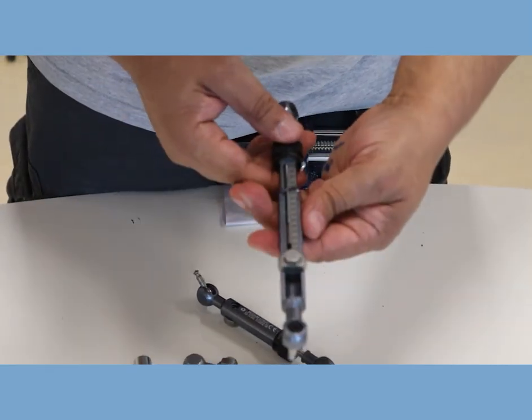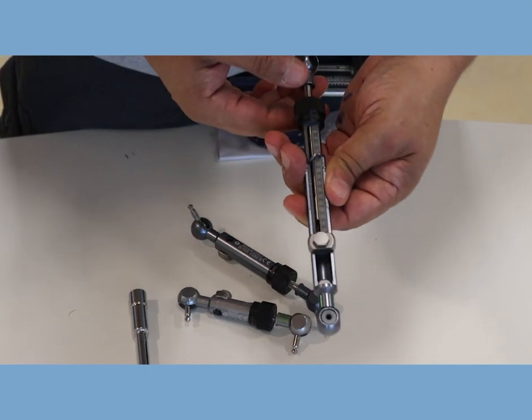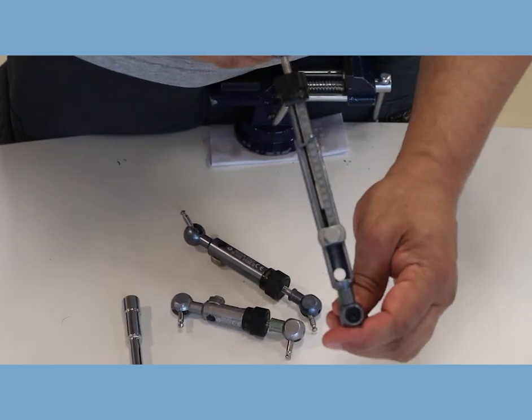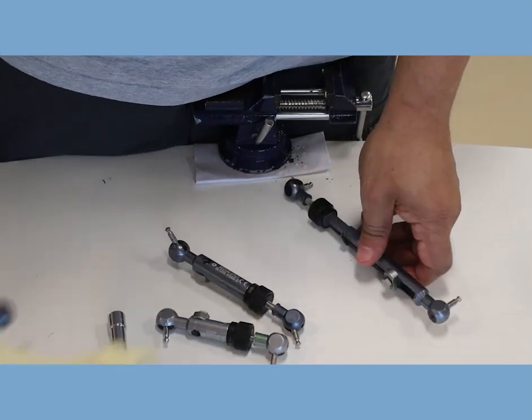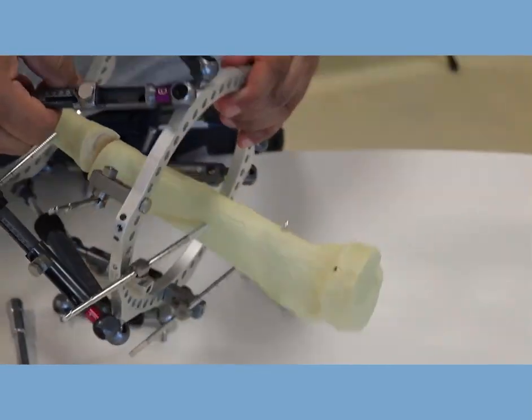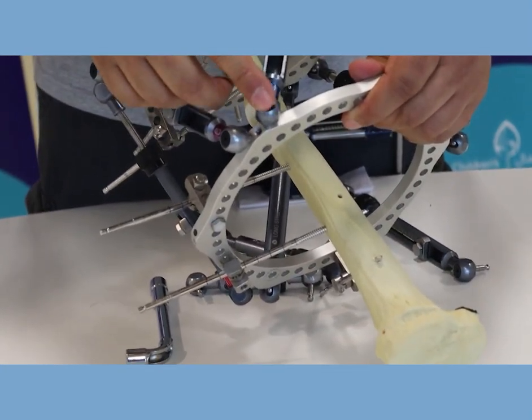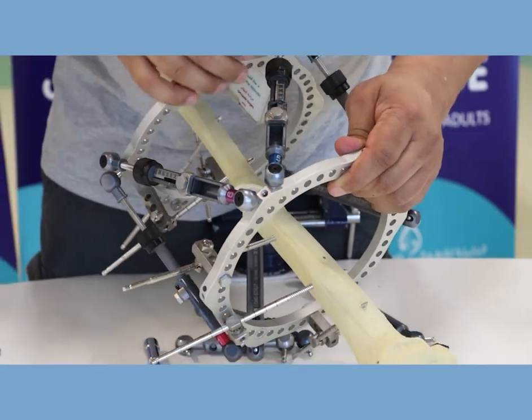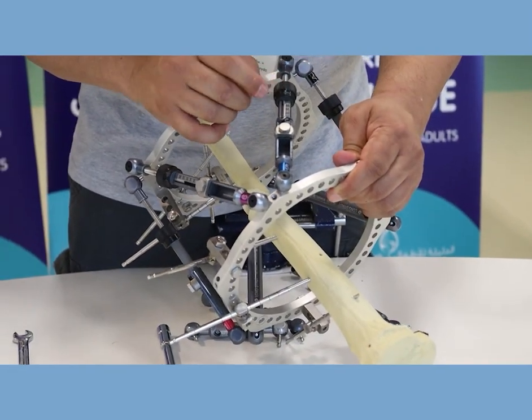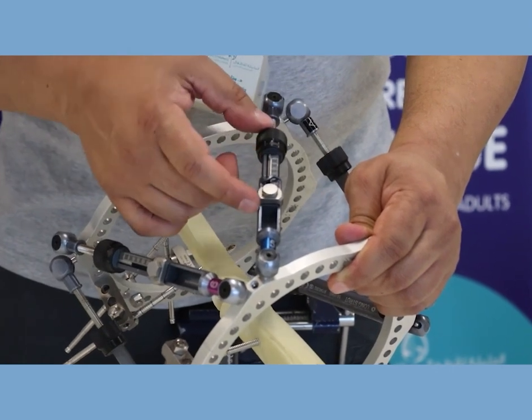The other one is the gradual correction mechanism which is this one with the knob here. These are usually fixed to the top and bottom of the ring. For example, in this frame, this is fixed at the top and this is at the bottom. You can see here on the knob there's an arrow. If you turn the arrow toward the plus sign, this is going to lengthen the strut.